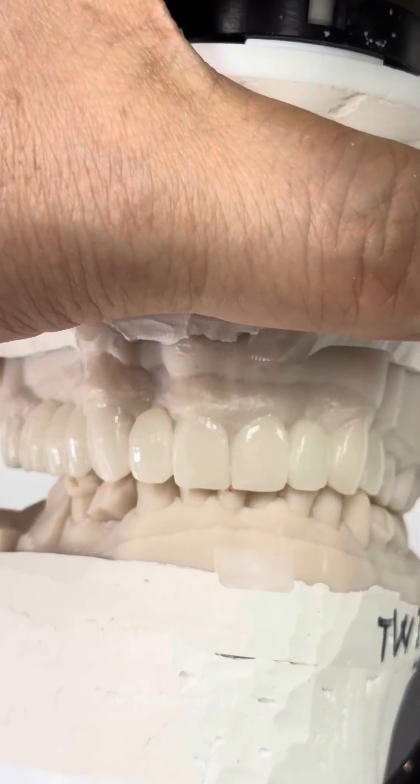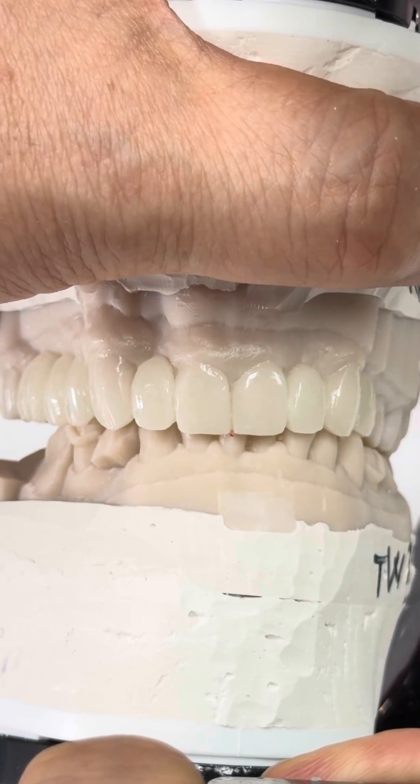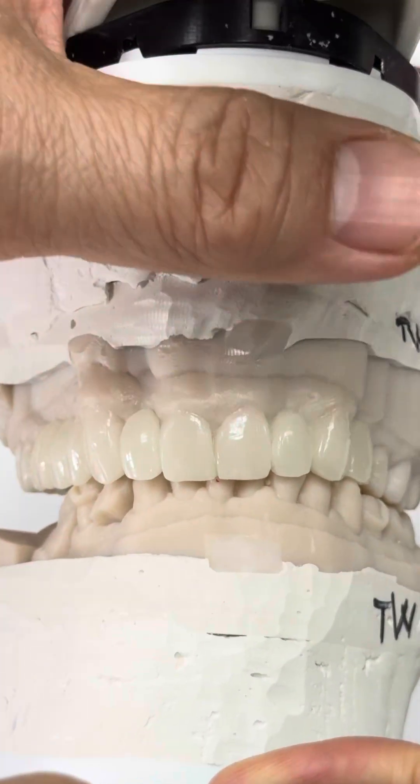Of course we have to make sure the incisal length and also symmetry, the buccal corridor. You cannot make it really out for that premolar but kind of matching it.